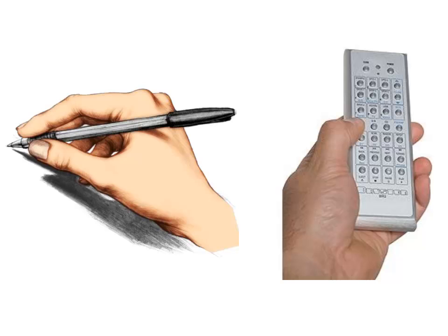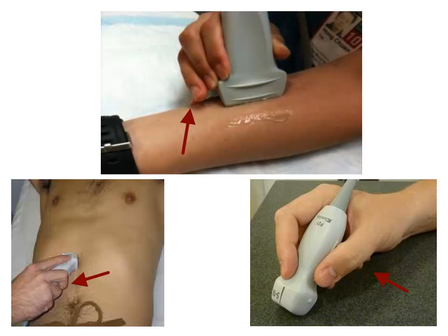The advantage of the remote control hold is that you can exert pressure when pressure is needed to diverge soft tissue and to get to the area of interest in obese patients, for example. And it's usually a more relaxed hold if you're scanning a low area relative to your standing position. But holding the probe is never correct until you get your hand anchored to the patient's skin. In these three examples, the red arrow points to the anchoring point, which does not need to be wide or prominent, as long as you can feel movement if the patient or the transducer are shifting relative to one another.